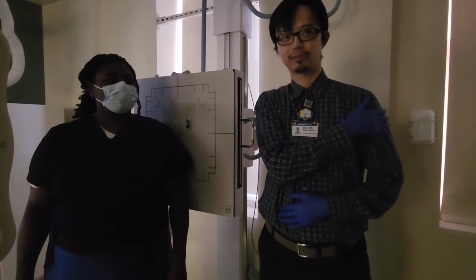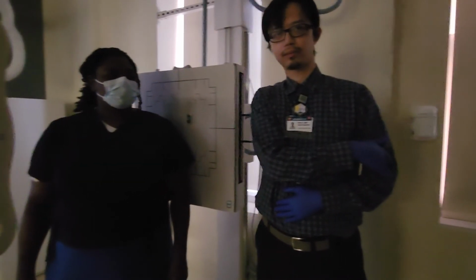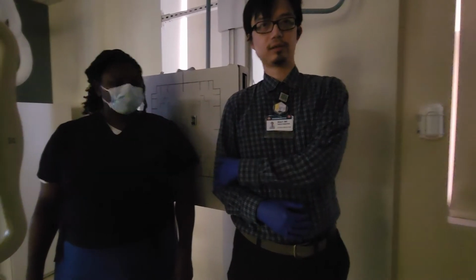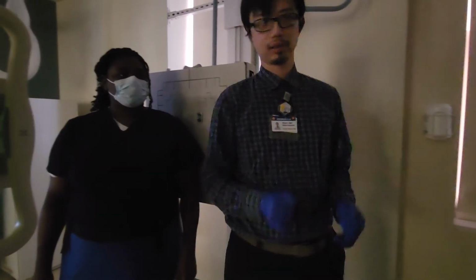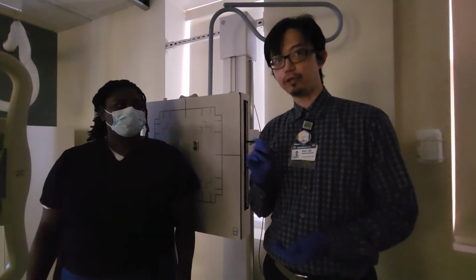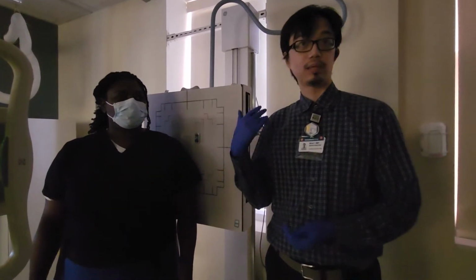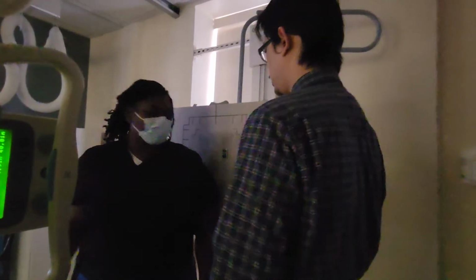Why not? Because the epicondyles are almost at a 45 degree angle. That's right, epicondyles, right? Not perpendicular to the IR, so not a true internal rotation. Okay. When we do the Y view in clinic, it usually comes with the normal AP internal and external shoulder. So Shamika, back against the board, please.